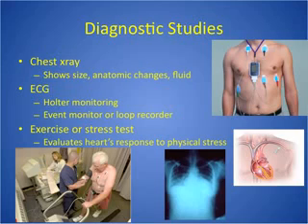The exercise stress test, the picture that you see there in the lower left, will evaluate the heart's response to physical stress. So oftentimes people that are being worked up for cardiac disease will have this done. People that have existing cardiac disease oftentimes have this done once a year to monitor their progress. The other thing it will do is define limits for exercise programs, because just because you have cardiac disease doesn't mean you shouldn't be exercising, but it means your limits might be different.